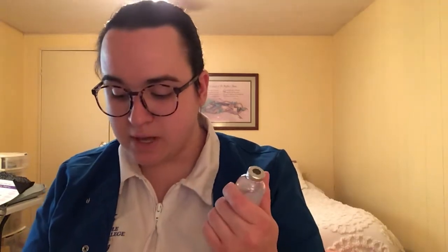And next I'm going to do my first set of rights with my B12. So this is for Anna Powolowski, date of birth May 5th, 1957. She has an allergy to penicillin, which her reaction is hives. The amount is 500 micrograms, but the concentration of the B12 is 1,000 micrograms. So I would give her 0.5 ml, half that amount, to reach the desired dose, which is 500 micrograms. The route is subcutaneous and the time would be now, which is 16:20.